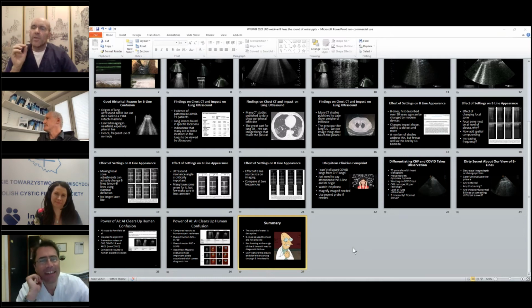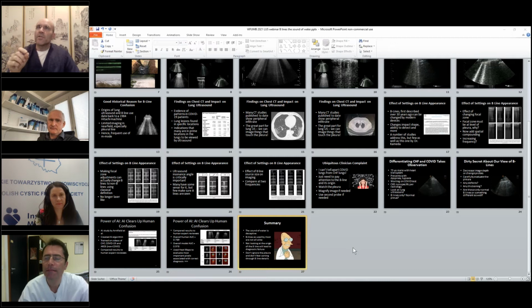So it has to be something that's consistent, reproducible, and a score, unless you want to draw every time on a patient's chart where lesions were and what they looked like. Ideally, it would be automated or some sort of a score that's available in the medical record, because even for one person, if they're busy enough, that'll soon fail, and then especially over days. So I think pick a lung score system that you like, that fits with the exam you prefer to do, and utilize that and document well.